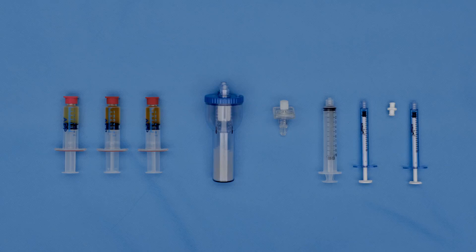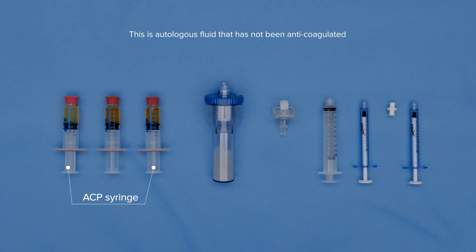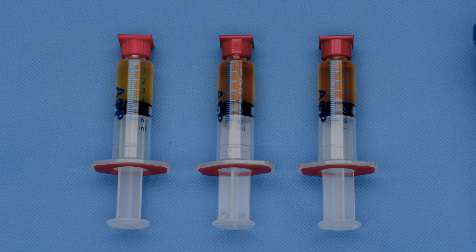Hi everybody, today I'm going to show you how to use the thrombinator device. For that you need in total 12 ml of ACP divided into 3 ACP syringes, 4 ml per syringe.